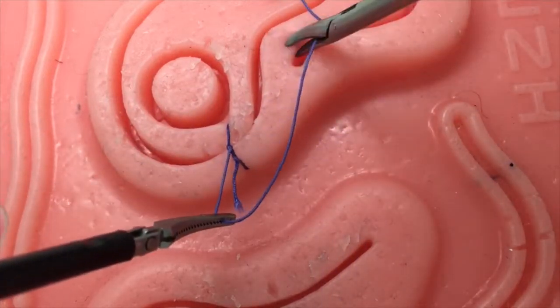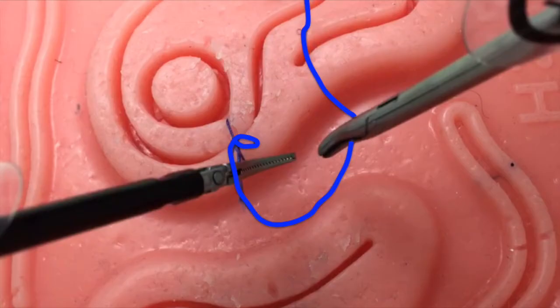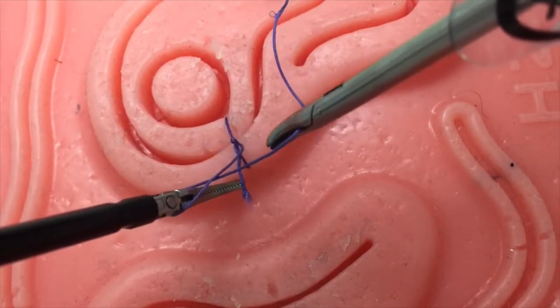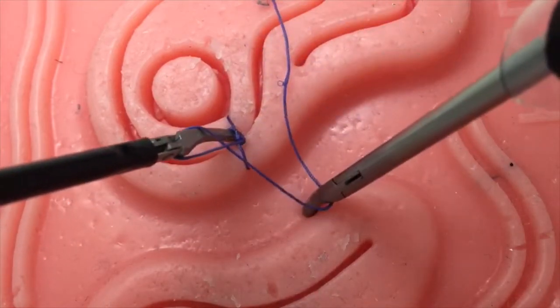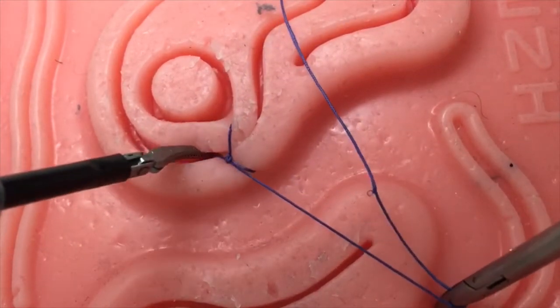In order to tie in a square fashion, place your left instrument outside of the U. Then, twist the stitch to wrap around your left instrument. Grasp the loose end with your left instrument and again cinch down the knot.